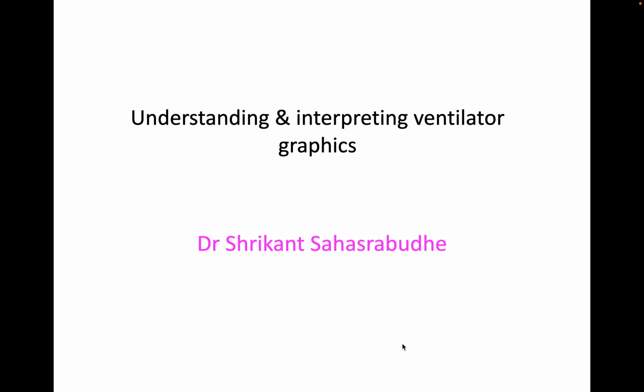And this time I will be discussing something about mechanical ventilation. And again, I have divided this into two videos. So we'll discuss understanding and interpreting ventilator graphics, and it is one of the most important subjects which we deal with as an intensivist day in and out.